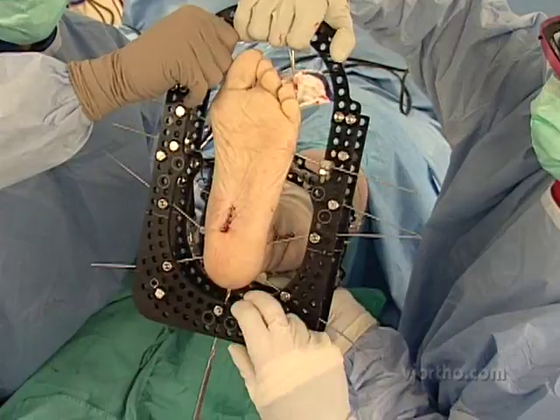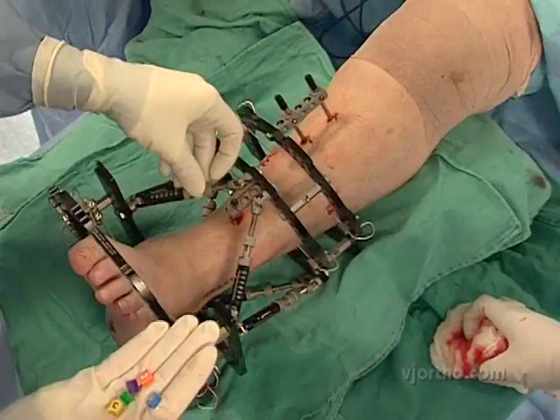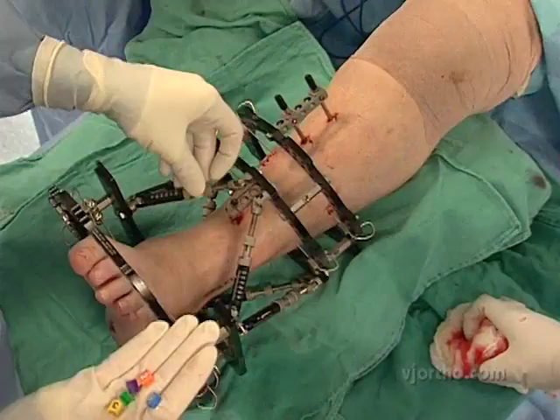Here is a little number — the computer will tell us what to do, but we need to know which struts to turn. We'll match these corresponding numbers: one, two, three, and then work our way around. Every one of these pin sites gets a zero-form dressing and a little figure-of-eight dressing around it.